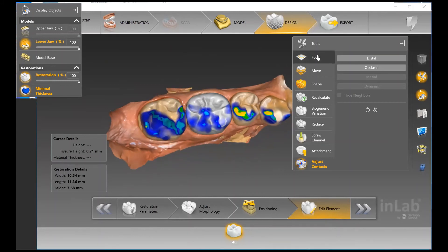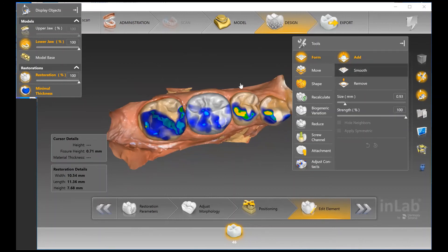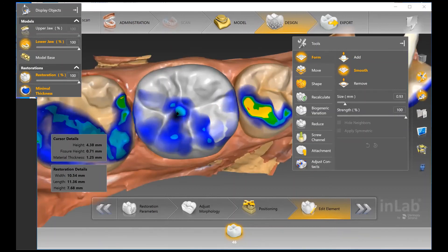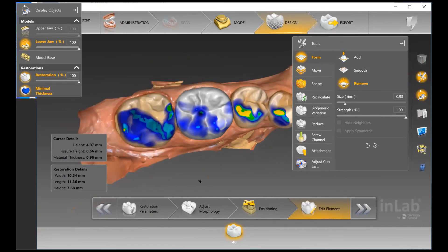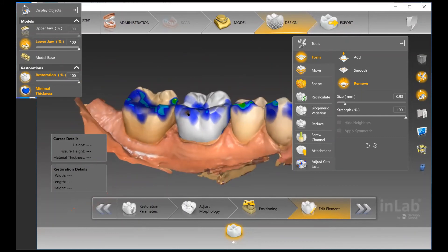With the Form Tool, I can go in and smooth some additional areas softly to make sure I'm not taking away too much material. When using Adjust Contacts, it's adjusting your contacts based on your parameters while still protecting things like minimal thickness — a nice way to adjust as needed.